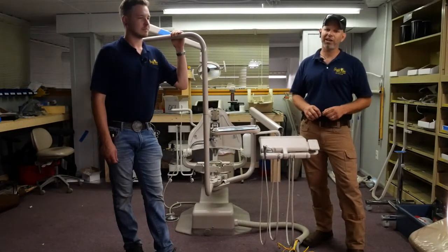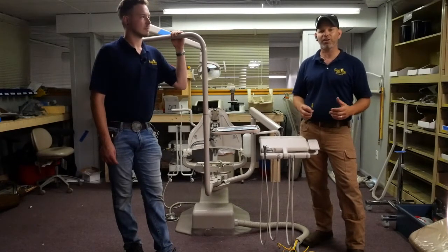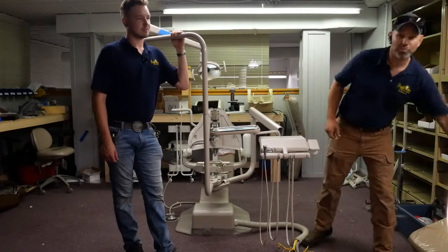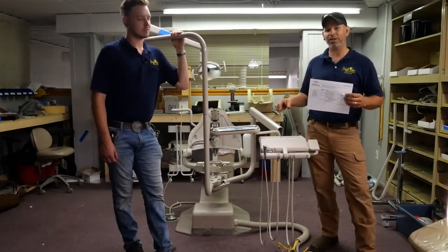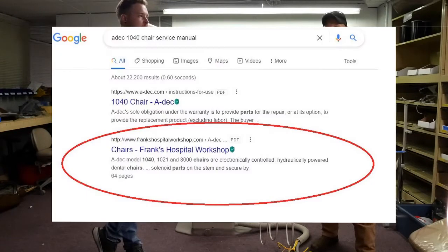So today we're going to show you at least 3 things regarding this chair, the first of which is how to actually adjust that speed, which might be something that is driving you crazy. So the number 1 step on how to do this is to print up the instructions for your particular dental chair. Now this is an Adec 1040, and the way I was able to get this instruction is I googled Adec 1040 and I was able to find this off of Frank's hospital workshop.